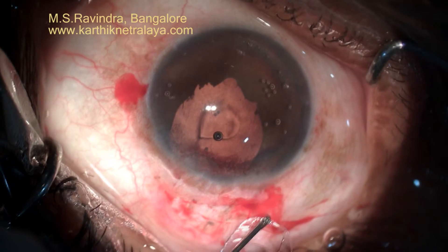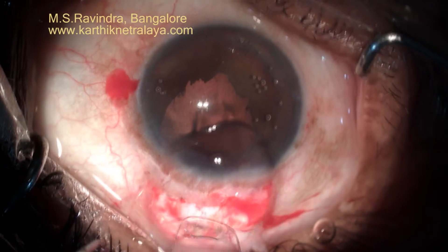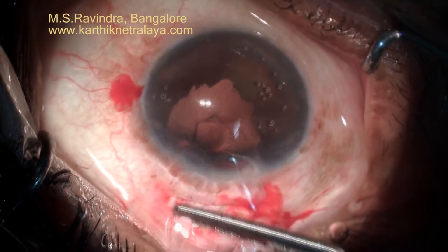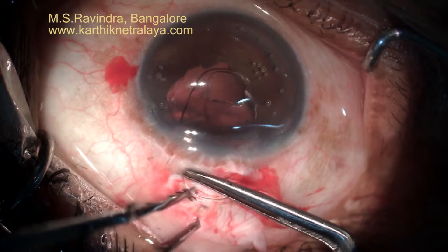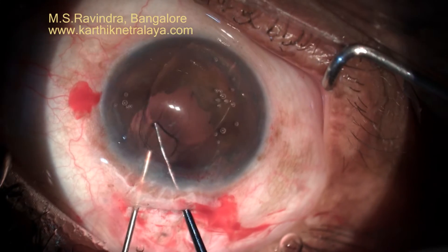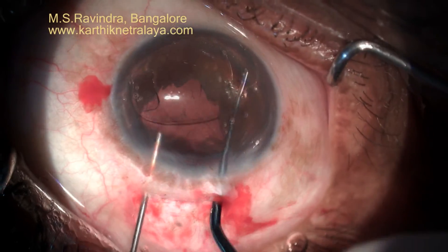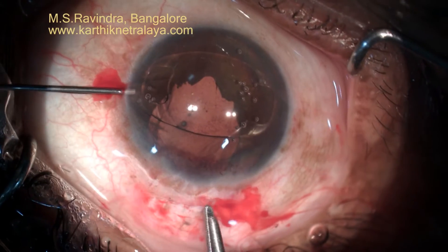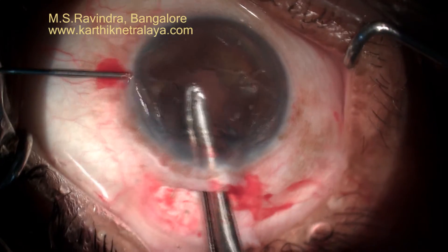I am just confirming that the slits are there. You should not manipulate the haptics too much otherwise they will break very easily. Slide it through the viscoelastic that fills the anterior chamber and rotate it in the direction of the entries you have made with MVR blades using a Sinski hook. Hold the optic close to the haptic-optic junction.